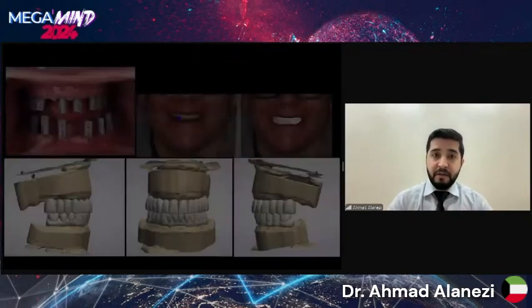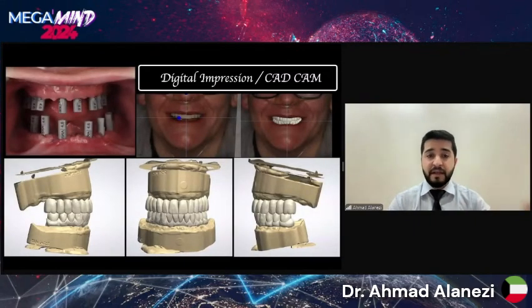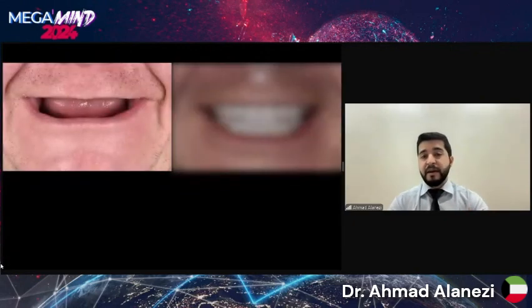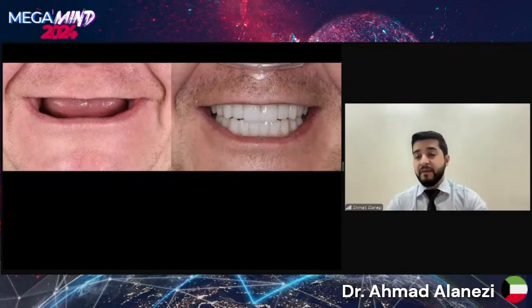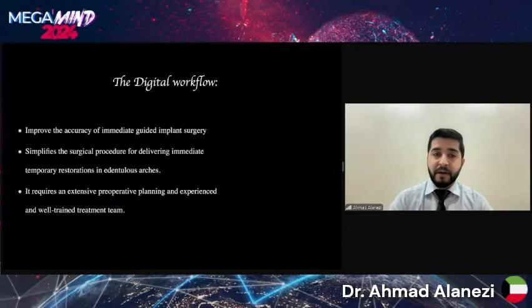Then, about three months after, the patient comes for digital impression and CAD/CAM designing. This is how the patient started, and this is how he left, and we wait for another 3 or 4 months for the patient to test drive those prostheses. That's our OPG. This is our patient again, orally.